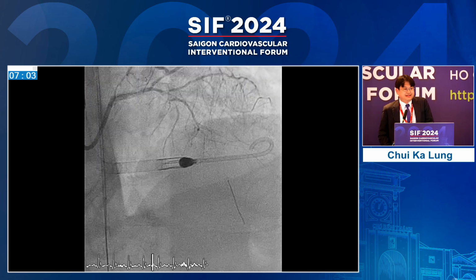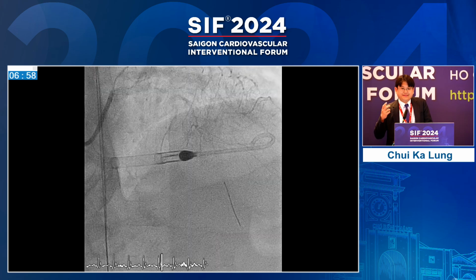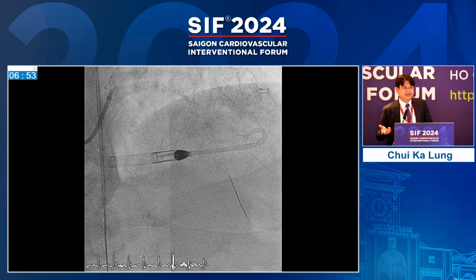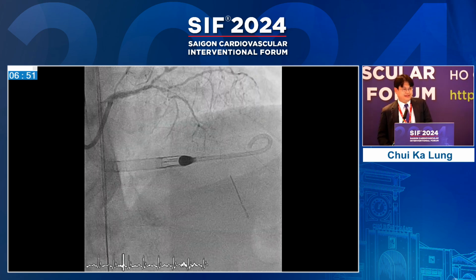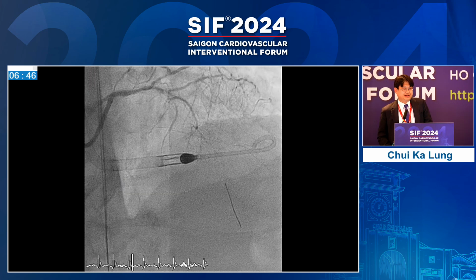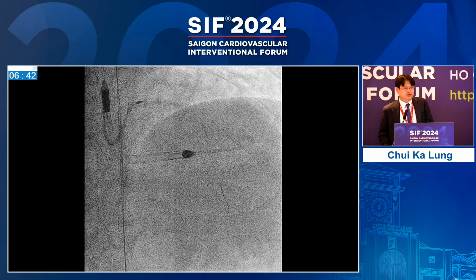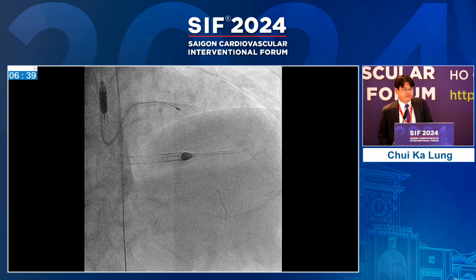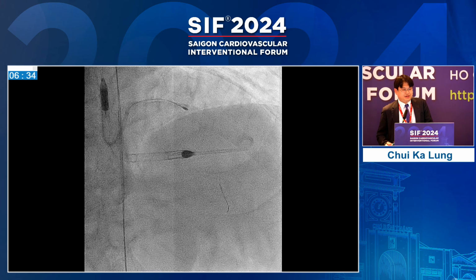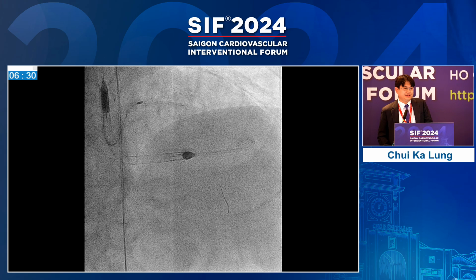So this is the check angiogram, because we also puffed before, and we found that basically there's no-reflow phenomenon, and you don't see any flow down the LAD. That's why the patient is crashing. And after we put in the impeller, we continue our work. Luckily, during the CPR, we don't lose our wire position. And then we continue to use the 1.25 burr to complete the task. So this is the 1.25 burr. We managed to pass through the tight lesion in the mid.